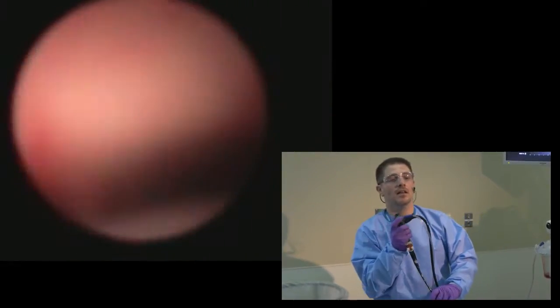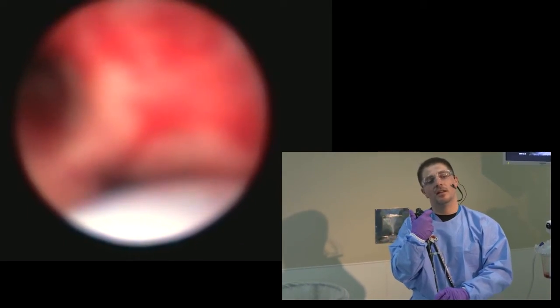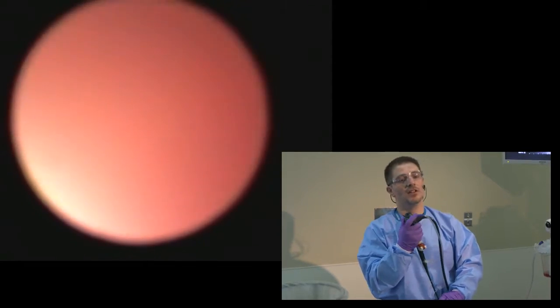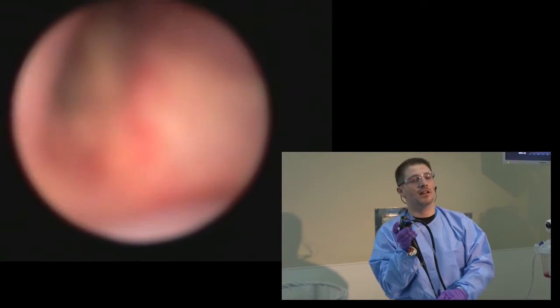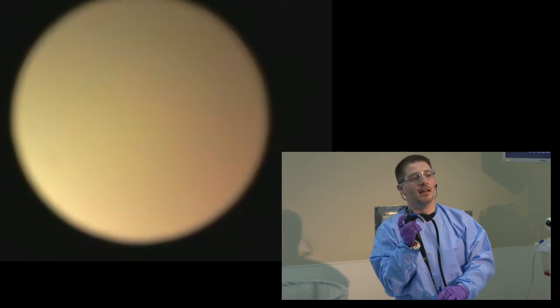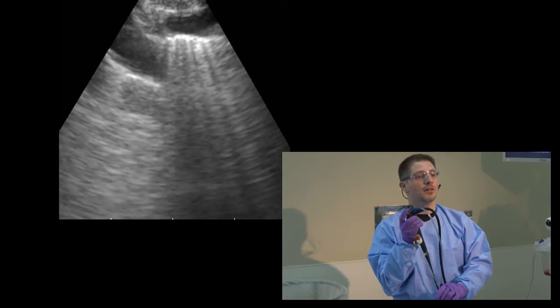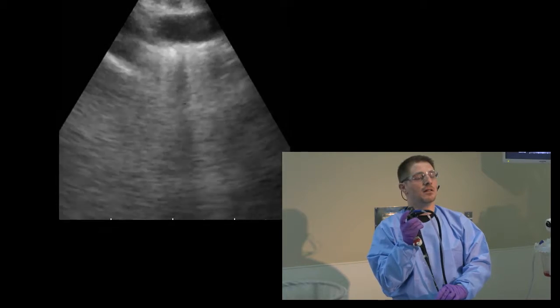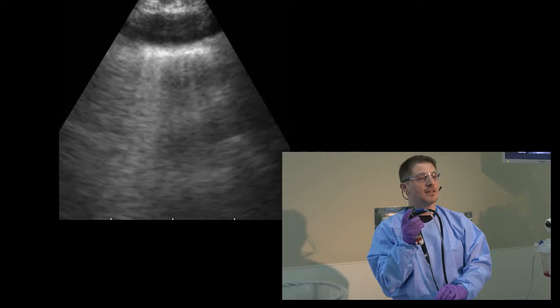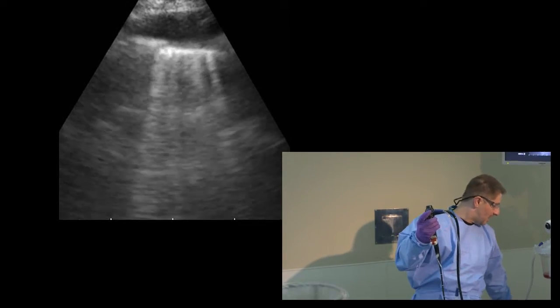Our location is the right paratracheal lymph node. In the endobronchial view, you start by going to the right main stem, turn laterally to identify your right upper lobe, which you see here at 12 o'clock. Then you pull back and thumb down, and now you look at your endobronchial ultrasound landmarks, which is mainly the azygos, which you see now as pulsating blood vessels in front of you. And you can identify it by adding color.